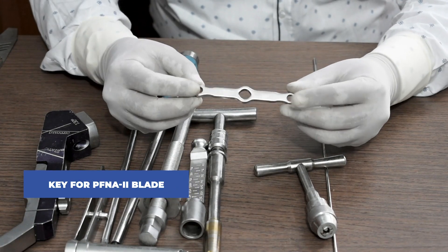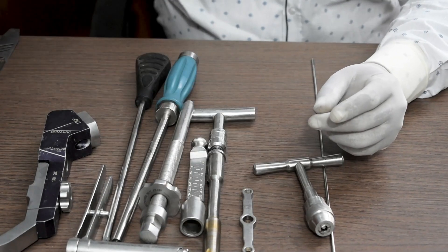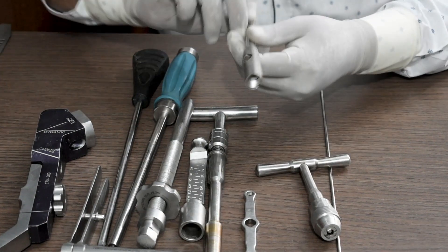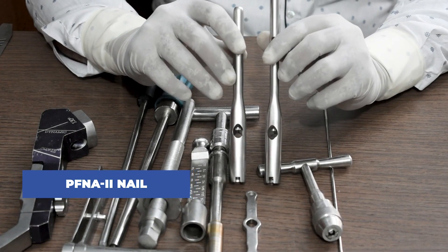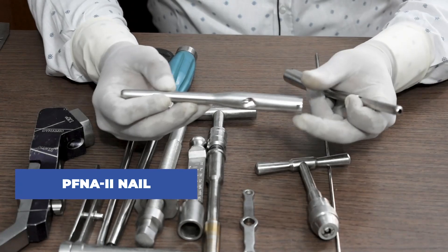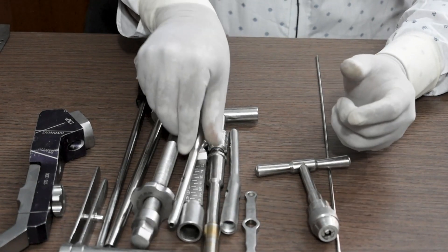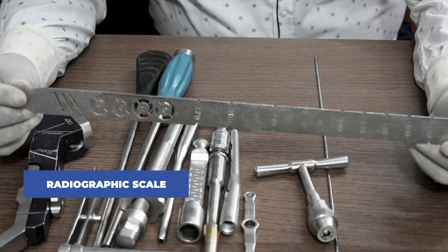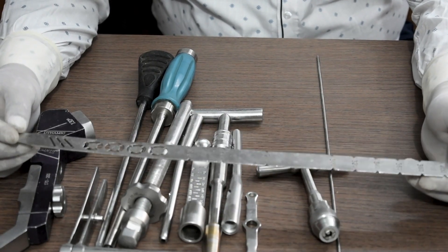This is the key for the PFN A2 blade. This is the PFN A2 nail — it is available in different sizes and is a site-specific nail. This is a radiographic scale, used to measure the diameter as well as the length of the nail.